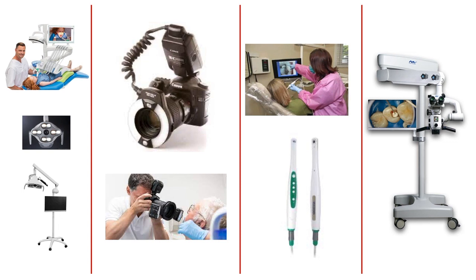This is used for still images and video recording, and mostly this kind of tool is used to motivate patients to clean their mouth, to tell them that they have a caries. But absolutely this kind of camera is not able to go inside the patient's mouth like the dental operating microscope.